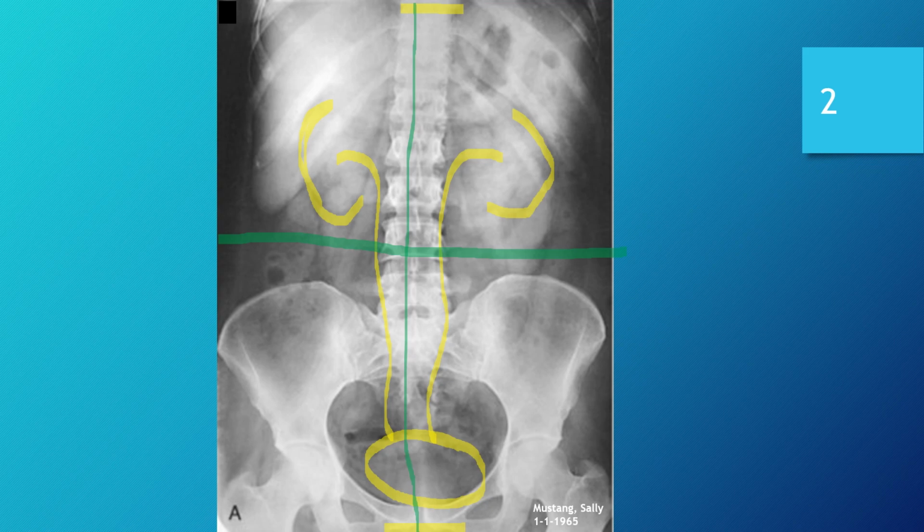Inferior superiorly, if anything, I believe that the image was perhaps centered a bit high, but once again, the required anatomy is present, so while it's not a detriment for this image, it does appear to have been centered just a bit high.